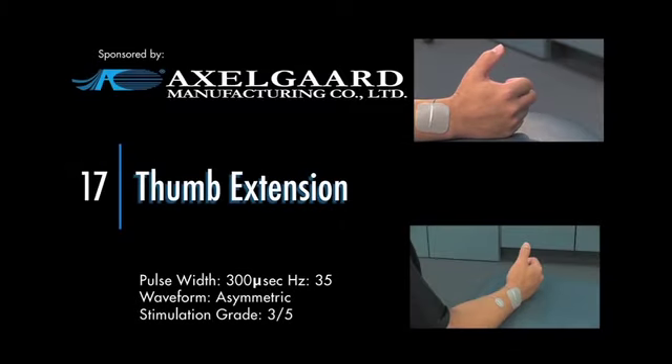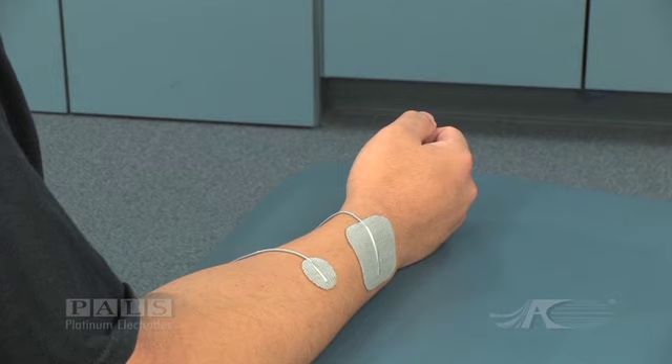Electrode placement for isolated thumb extension. The very small negative electrode is placed about two-thirds of the way down the forearm over the extensor surface. The positive electrode is over the extensor tendons.